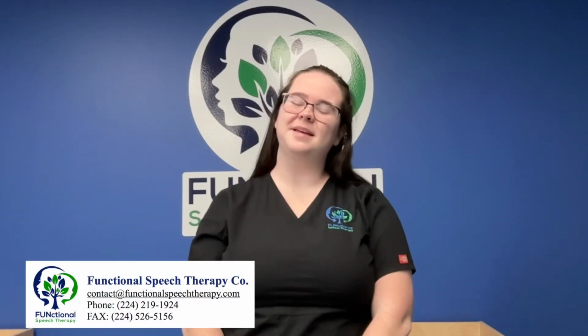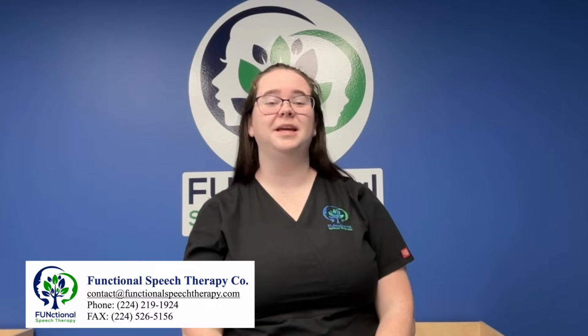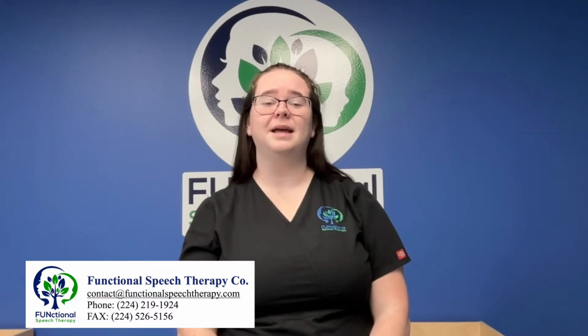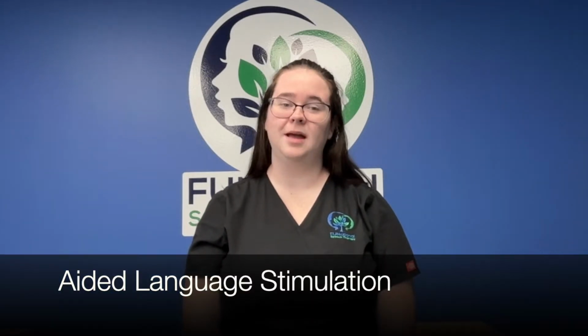I'm a speech-language pathologist working at Functional Speech Therapy in Fox River Grove in Illinois. In this video, I'll be talking about how to model AAC devices, also known as aided language stimulation.